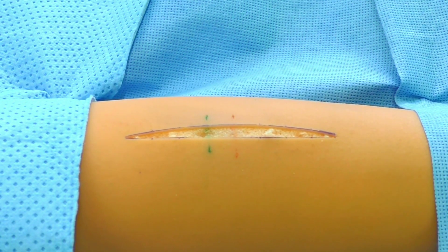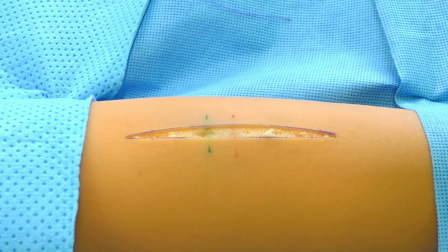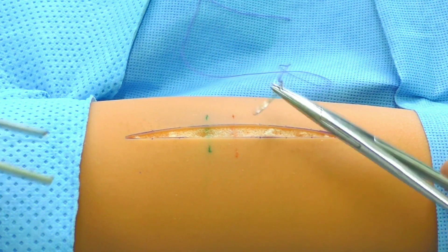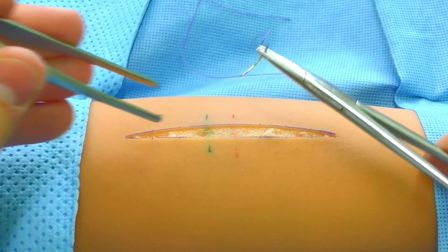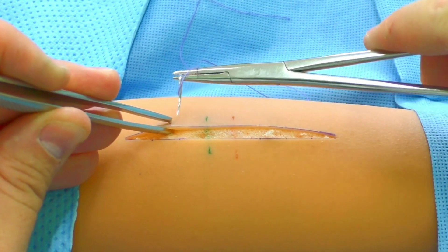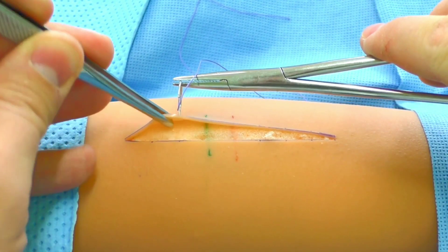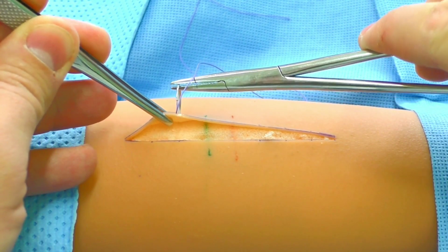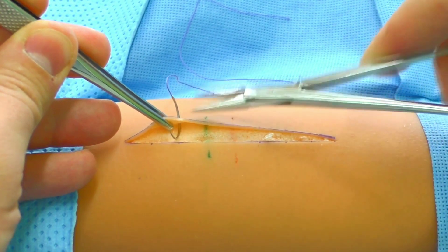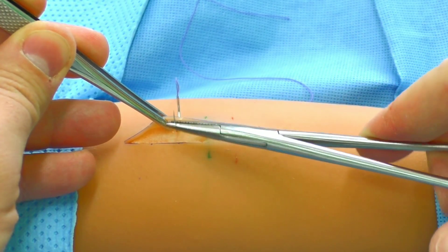The skin incision is fixed by the surgical tweezers and turned from oneself. The needle with a filament is inserted perpendicularly into the surface of the skin by a rotary movement of the needle holder, following the curvature of the needle.